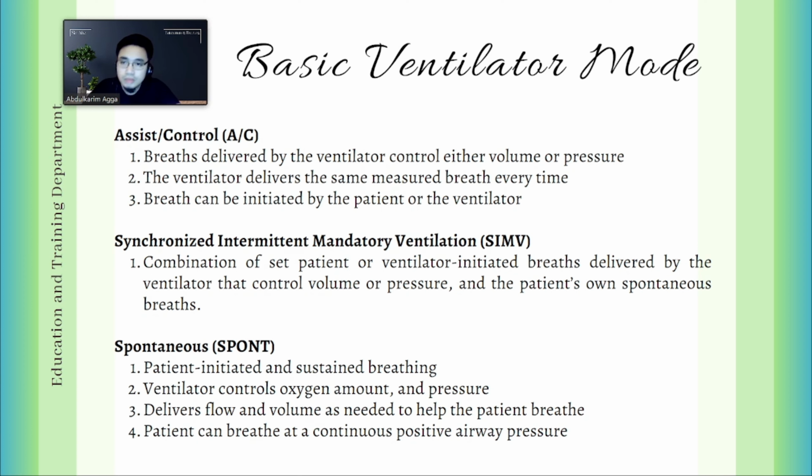When we talk about your assist control mode, or your AC mode, breaths are delivered by the ventilator, controlling either volume or pressure. So the one in charge here is the ventilator. The ventilator delivers the same measured breath every time, and breaths can be initiated by the patient or by the ventilator.